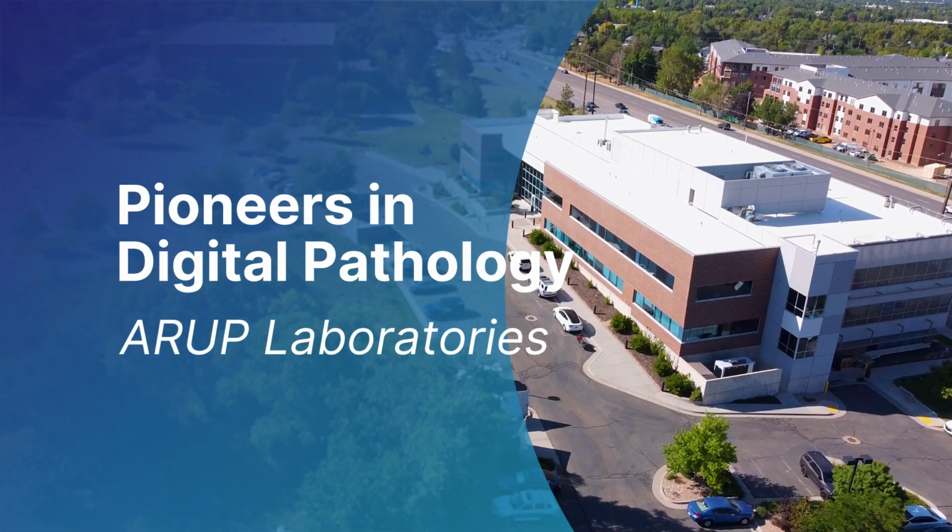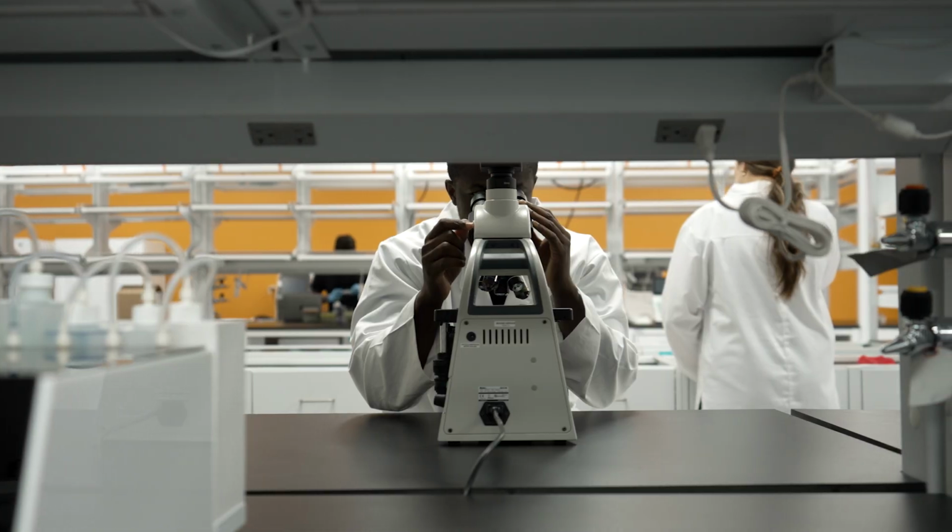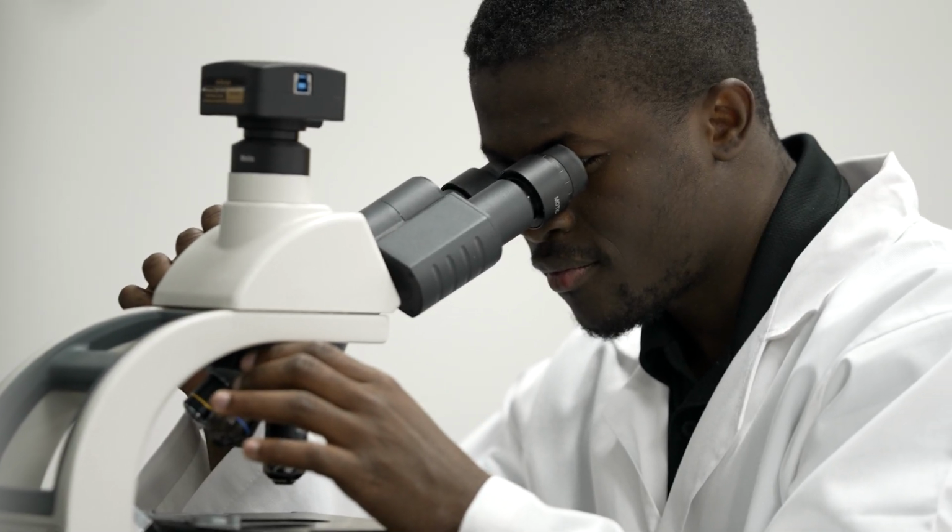My parasitology training is as a zoologist, not as a medical professional. I love their complex morphologies, which are their complex physical structures. In the human, it usually manifests as an immature stage and therefore lacks certain features to help in identification. A lot of times it comes back to needing a human on that scope, and that becomes a bottleneck. When the eyes get tired, the brain gets tired.